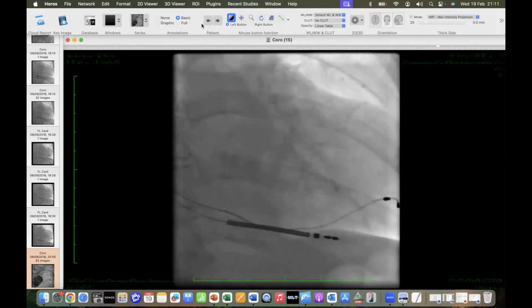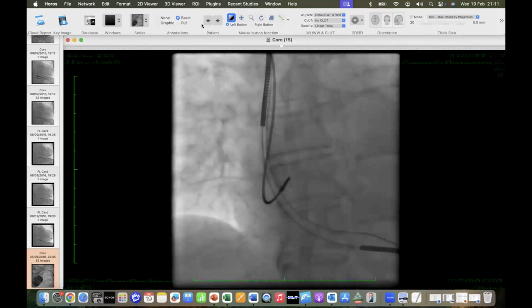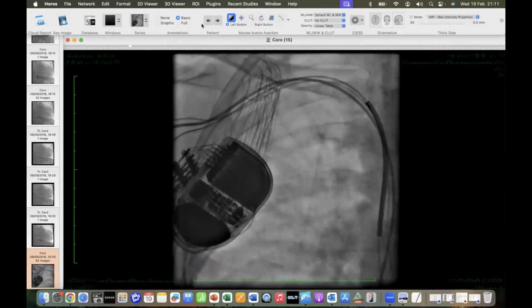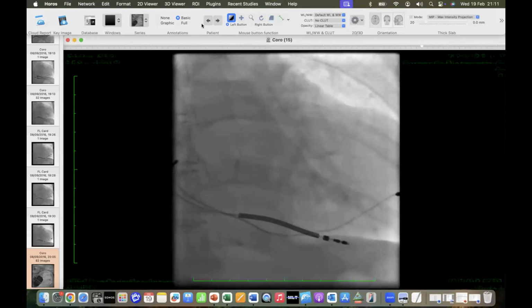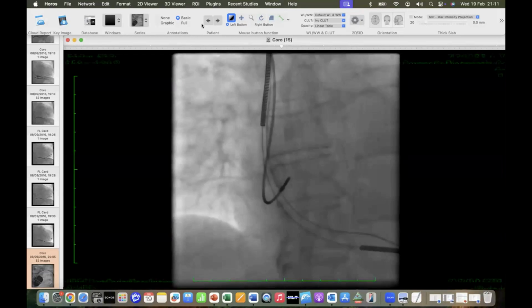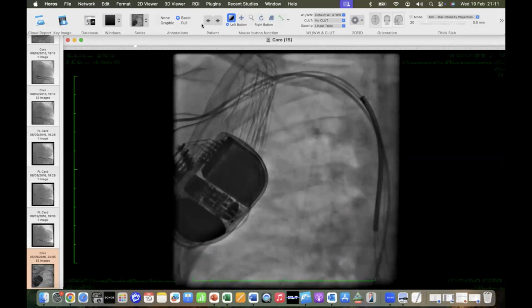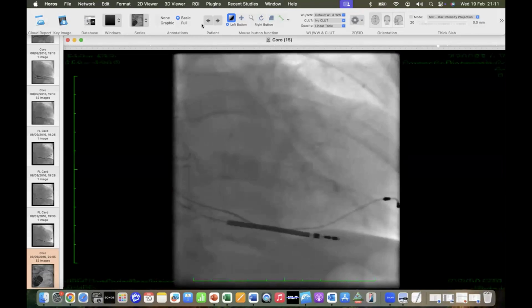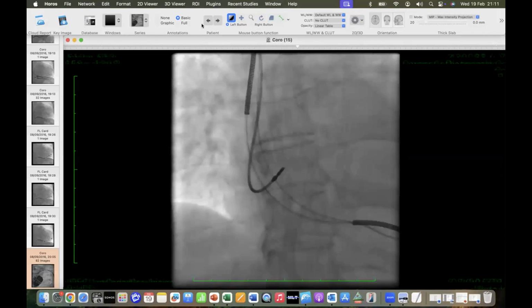Quadripolar leads have some advantages and some disadvantages. The advantage of a quadripolar lead is the multiple vectors, and I think last week I talked specifically about when a quadripolar lead is particularly useful. You get up to 10 different pacing vectors to capture the left ventricle, and with a quadripolar lead, you can actually place the lead tip at an apical position, but pace from a more basal or mid position, which is physiologically more likely to resynchronize.